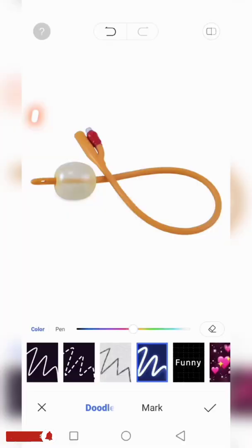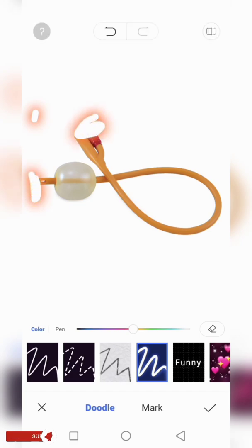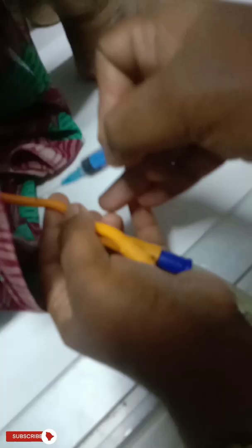This is an image of the Foley catheter. The patient end, the bag end, and the bulb are visible here. In this procedure, the bulb is inflated with saline or distilled water, but the line is now blocked. We first try to rupture along the line of this tube to rule out the blockage, and if unsuccessful, we will burst this balloon using ultrasound guidance.